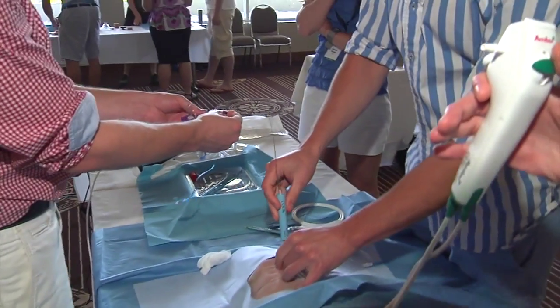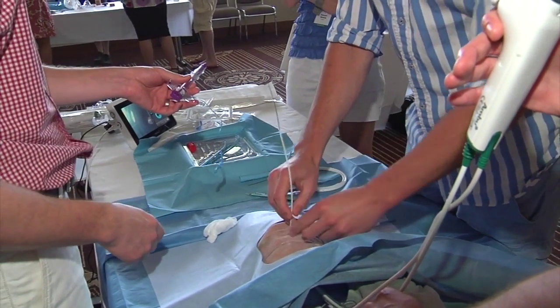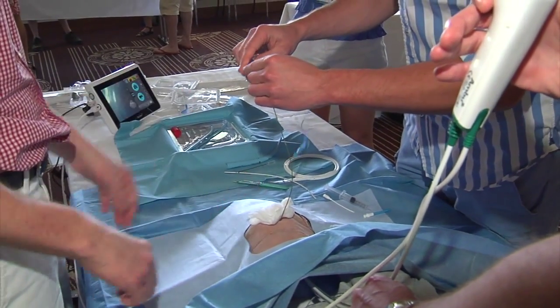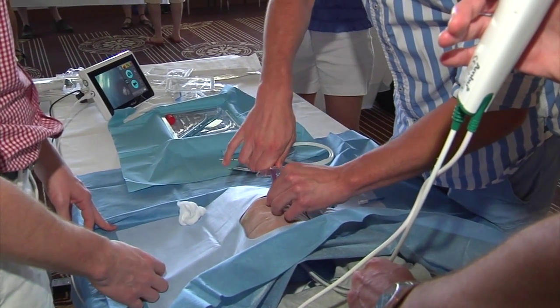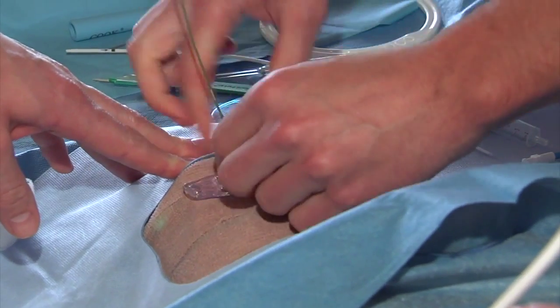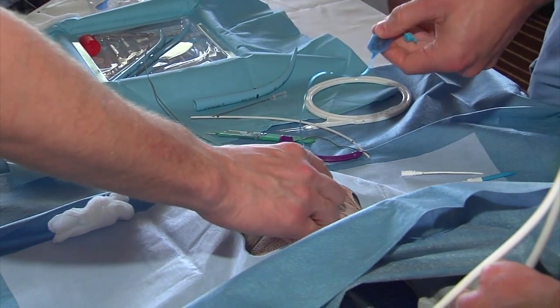Here's your tracheostomy tube. The cuff's been tested. I usually slick it back so it's a narrow shape and put some lube on it so it goes in more smoothly. The white inner piece comes out as well. You can disconnect the ventilator at this point if you want to stop extra airflow. This is again one slow slick movement — there's a bit of a clunk as the balloon goes into the trachea, which is normal. Keep holding the tracheostomy tube at this point.